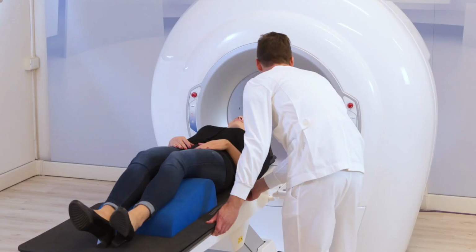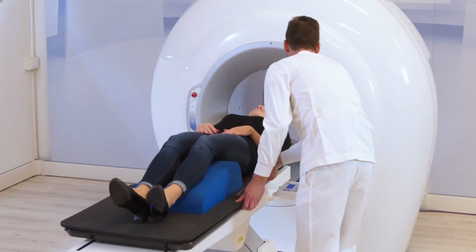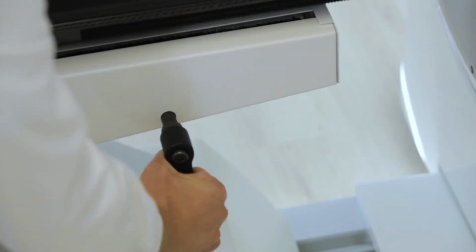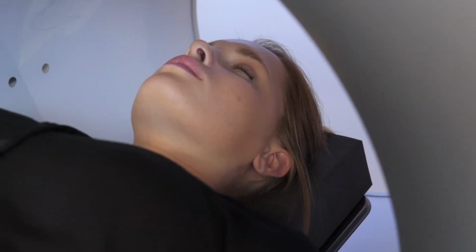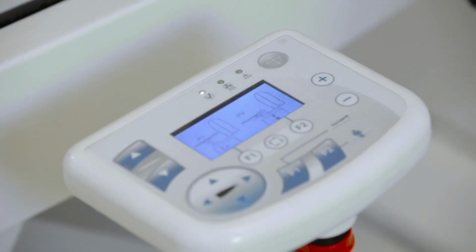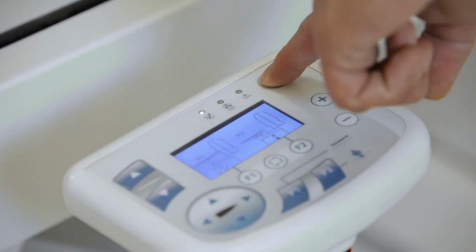Unlock the gurney and slide it to move the patient into the gantry, then lock it again. For precision adjustments, the laser centering device can be used. To activate it, press the laser key on the control console.